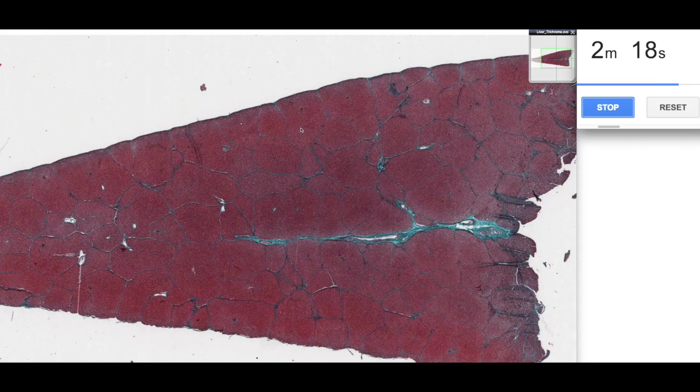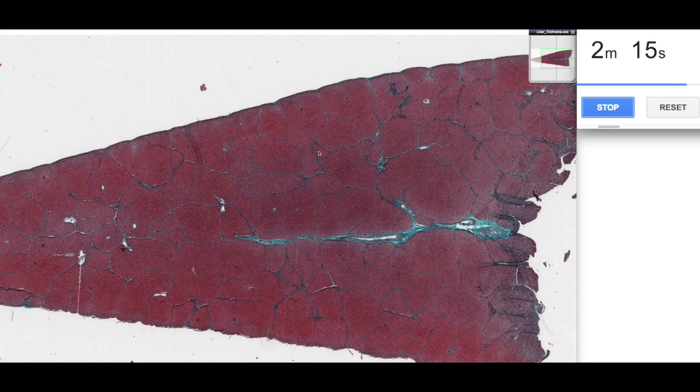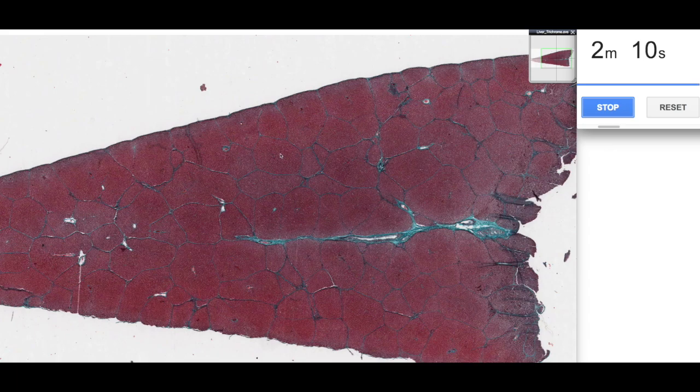So then there's another lobule over here and here and so on. You can see multiple lobules within this liver. So these are the main functional areas of the liver.